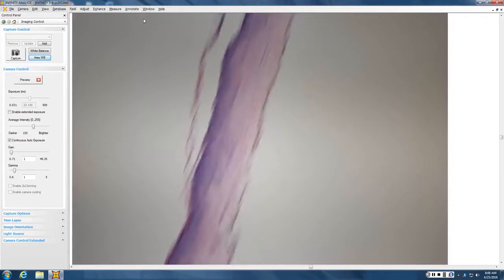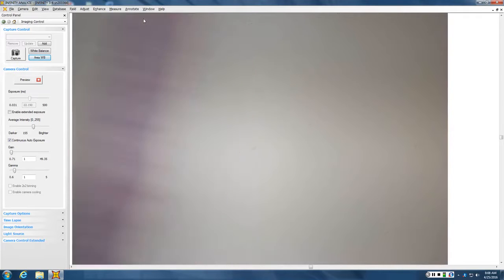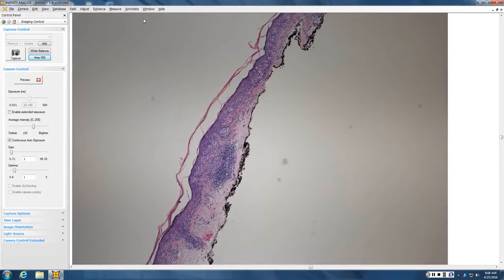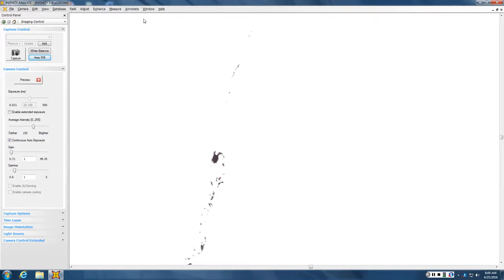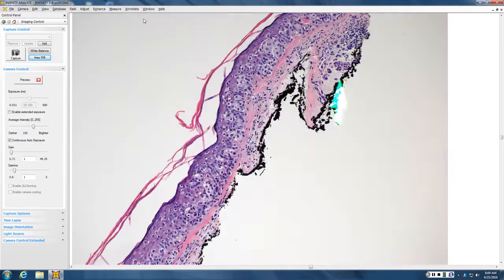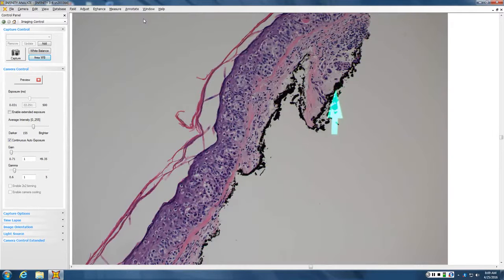Okay, Tom. Another common combined nevus of Reed? Probably not. We have a very broad melanocytic proliferation that has my hairs up for MIS at least, if not invasion, pagetoid spread. So you'd want to look at those cells in the dermis. To my eye, they're kind of bland.